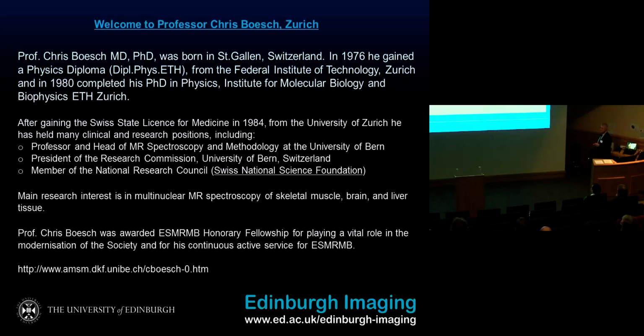We wanted to look at that in humans. And when you know diffusion-weighted spectroscopy, you can distinguish between free diffusion and restricted or hindered diffusion. If the droplets are small enough, we can see either a restriction or a hindrance. When we looked at EMCL, the extramyocellular lipids, we found a diffusion behavior from the left to the right: increasing diffusion weighting with increasing gradients, and what we expect, a very low ADC, because lipids are not water, so it's a very slow effect. On the other hand, IMCL was even worse. We had almost no effect of our diffusion gradients because the restriction or hindrance and limitation via the droplets was obviously so strong.